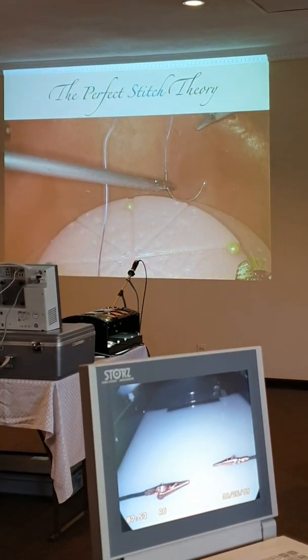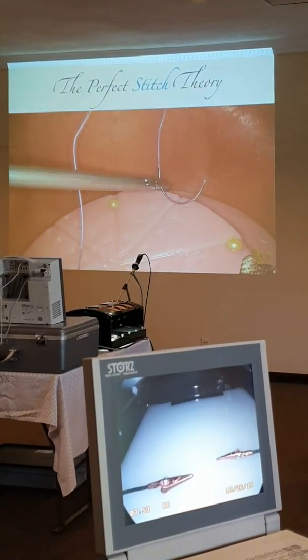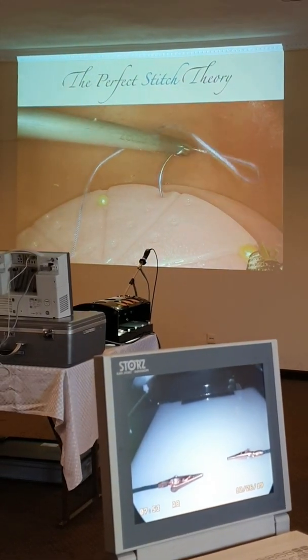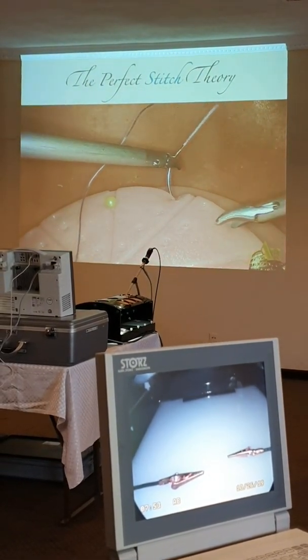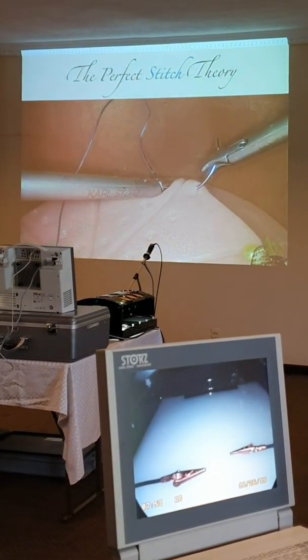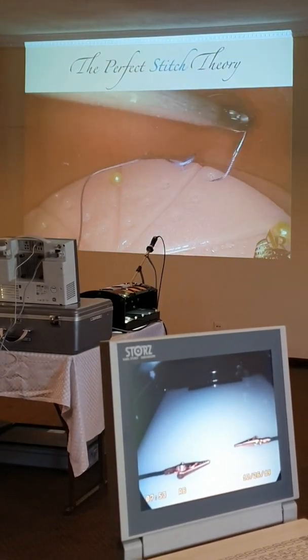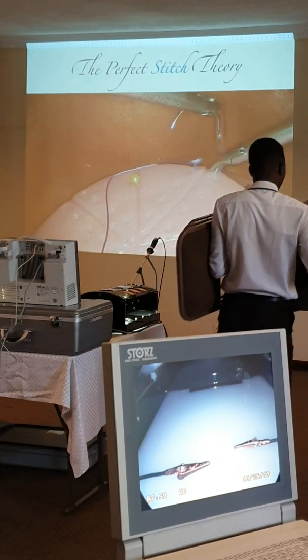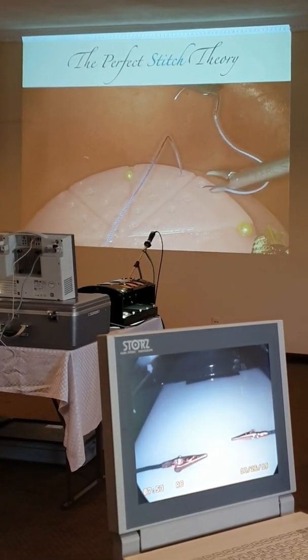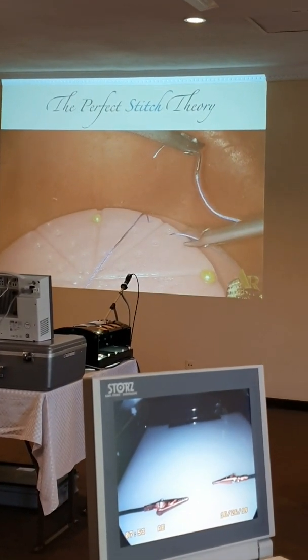And you will look when the professor does the verification, crossing, and now we enter the tissue, make a small rotation of the hand, pick up again the needle, make a little traction of the thread, and look why it's the perfect stitch.